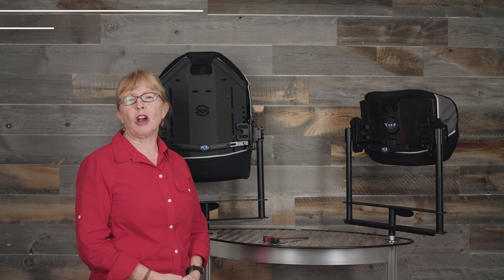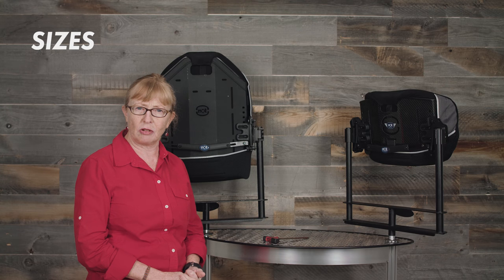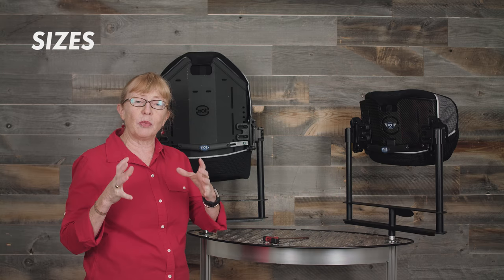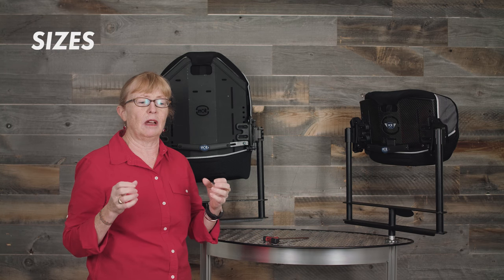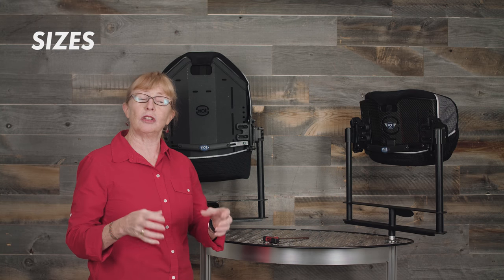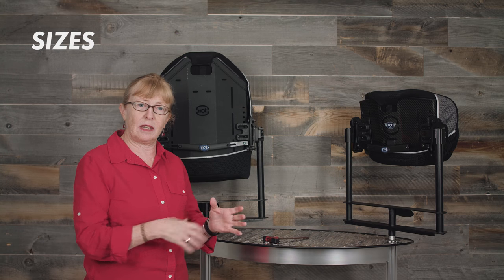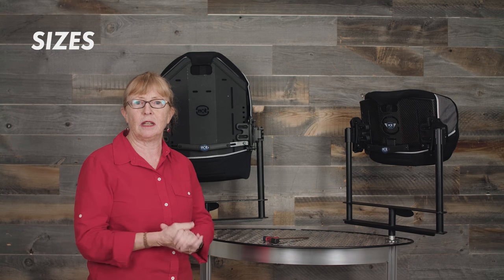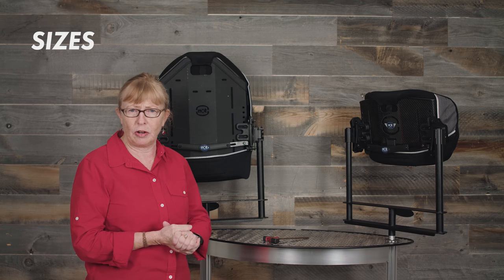The Optima Carbon back support is available in widths from 14 to 20 inches in one-inch increments. The one-inch increment is important — for instance, if you're prescribing a rigid manual chair and it's 17 inches, you want to be able to put a 17-inch wide back. You could still put in a 16 or 18, however this way you can have a fine-tuned back support for your client.